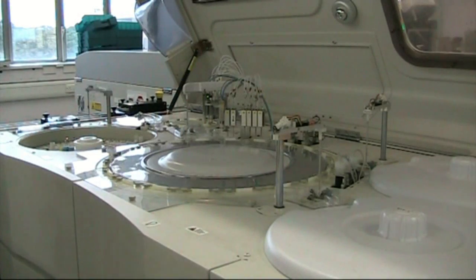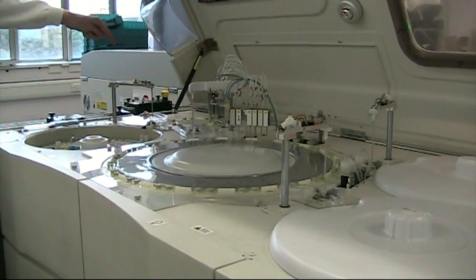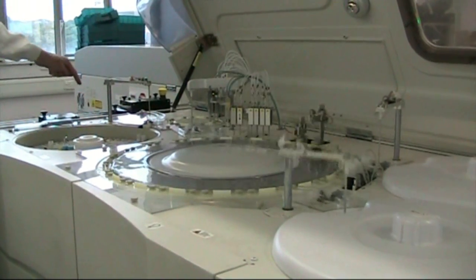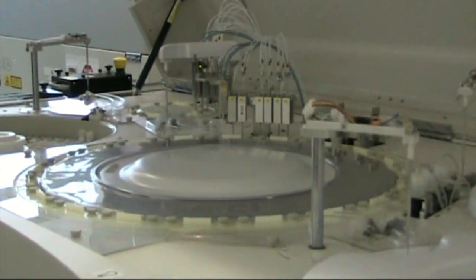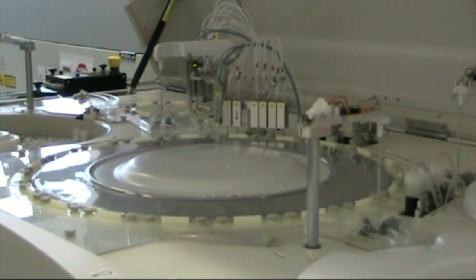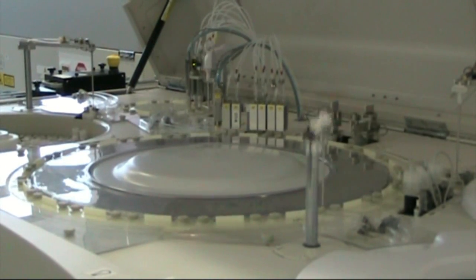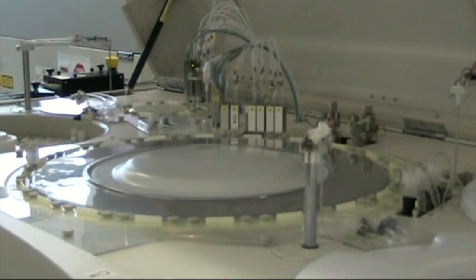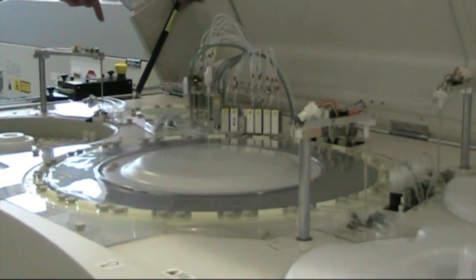Okay, so what we've got here is a sample probe on this side, which is taking sample directly from the track, from that sample there, and putting it into the ion selective electrode. So it measures sodium, potassium and chloride on this bit of the machine here, and then it puts an aliquot into that dilution turntable at the back.